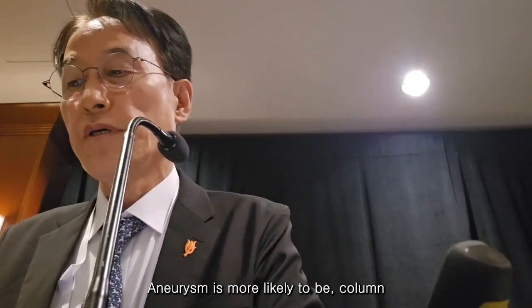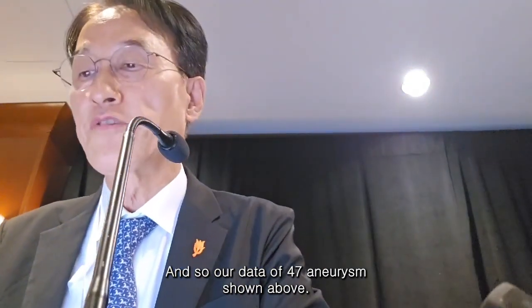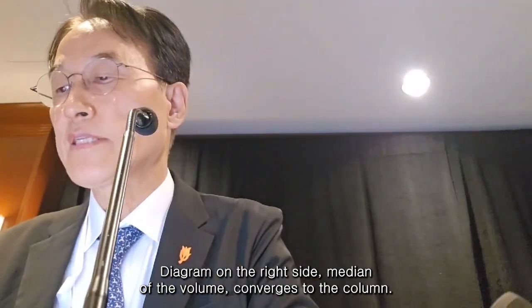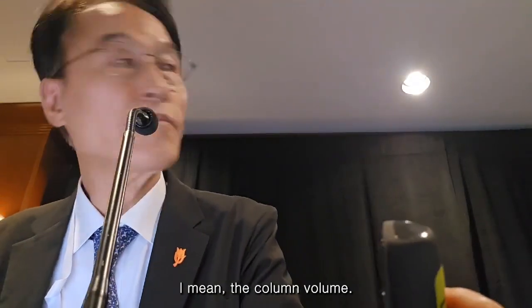Aneurysm is more likely to be column rather than sphere. So as our data of 47 aneurysms showed, in a box diagram on the right side, the median of the web volume converges to the column volume.